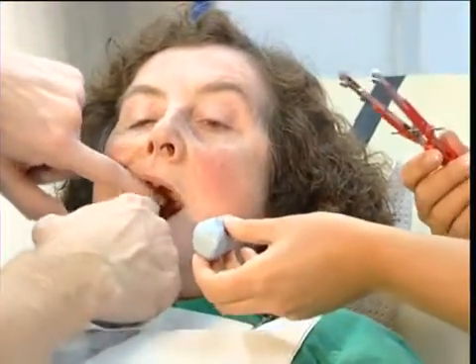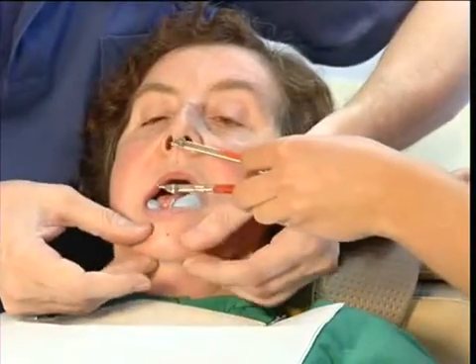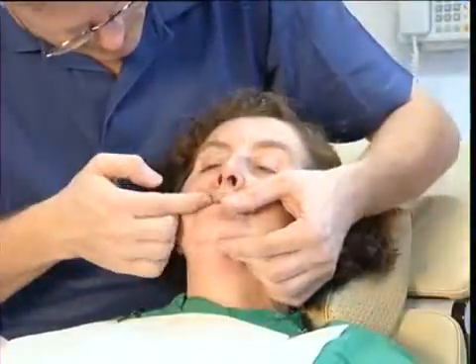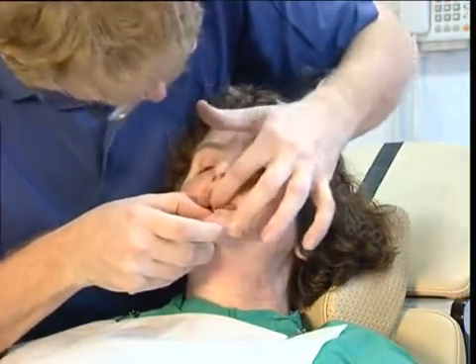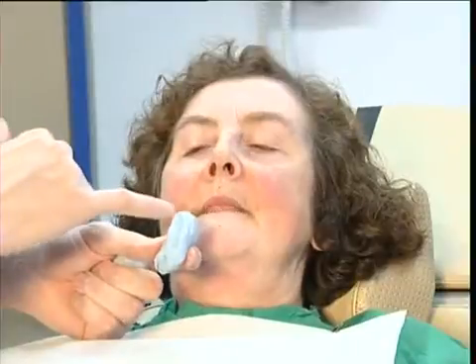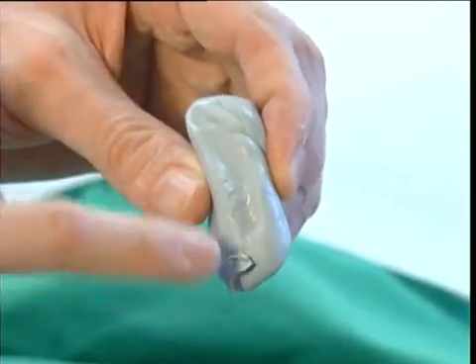The mandible is then guided to its centric position while monitoring the vertical dimension using the value recorded previously with a dividers or Artex meter. Before the silicone blocks set, ensure that they are in intimate contact with the upper alveolar ridges. This shows the 2 hardened blocks with clear registrations of the alveolar ridges, which will be used later for aligning the models accurately on the articulator.